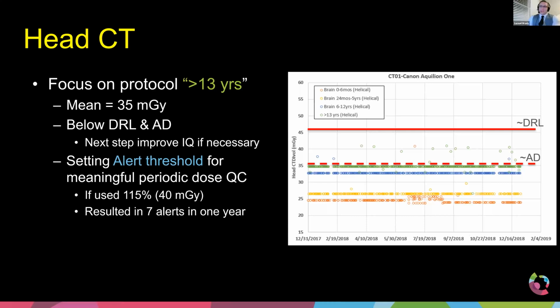When it comes to the ones that are really high, you can set an alert level in Radiometrics, but let's be honest here. You already know about it because we have alert levels at the CT scanner. And on the CT, you are not going to get that high unless you had to make a decision. What happens when the patient gets on, you scan them, and something went wrong with the contrast? There's an extravasation of the contrast. We had this happen when the contrast squirted out of the contrast injector instead of into the patient. We scanned the patient, so the contrast didn't go right.